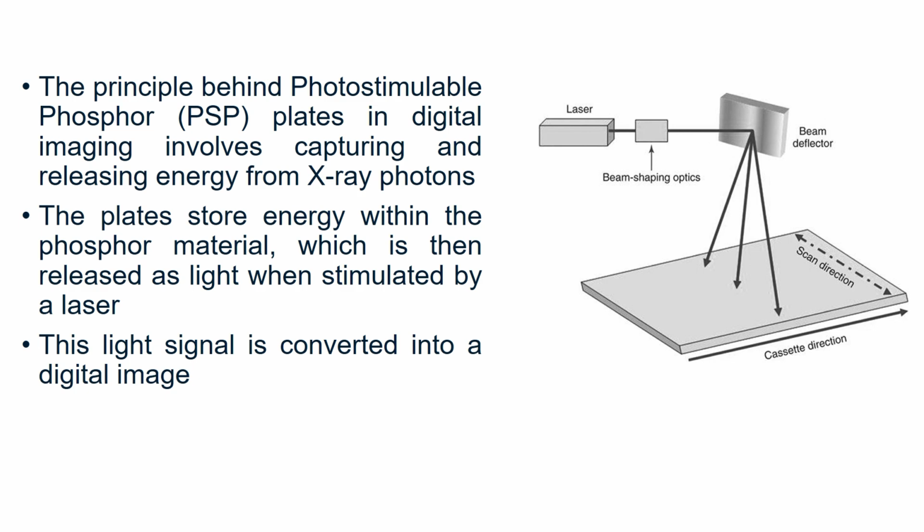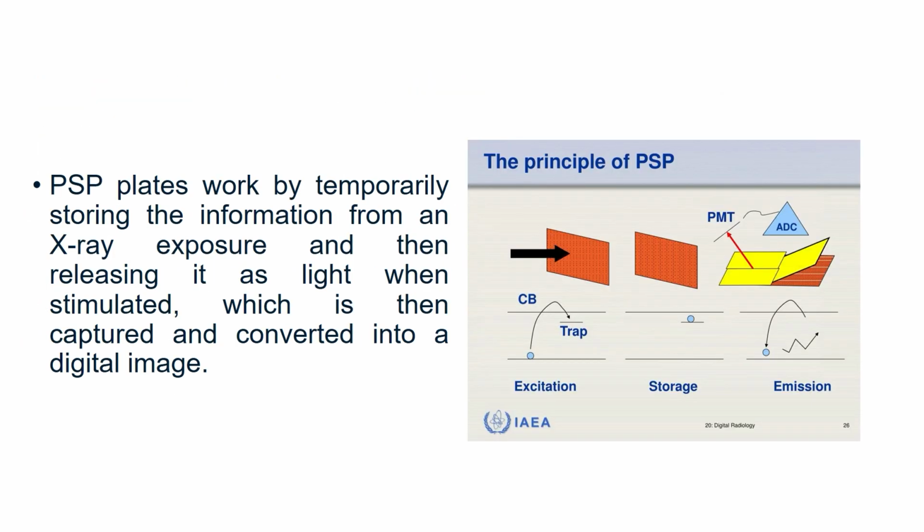So, remember that the laser is a very important component in computed radiography. This light signal is converted into the digital image.